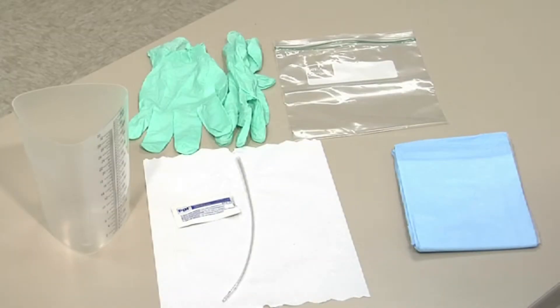Before beginning the procedure, be sure to plan for the student's privacy while the procedure is being performed. Review the student's individualized health care plan and/or the health care provider's orders. Gather the equipment and place on a clean surface.